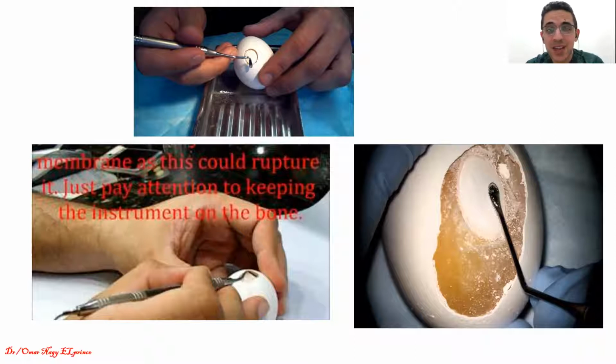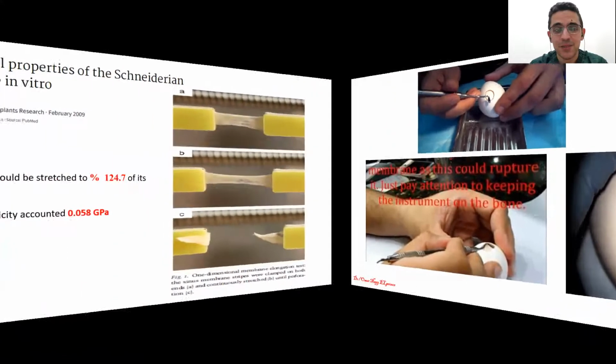How do you separate the membrane from the eggshell itself? It takes a lot of meticulous work to master this, but it eventually pays off if you practice a lot.